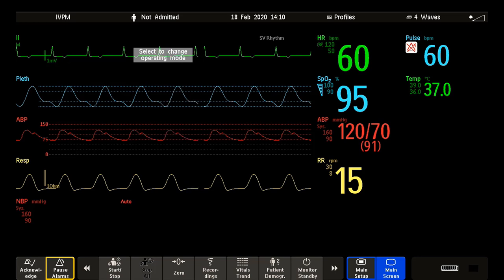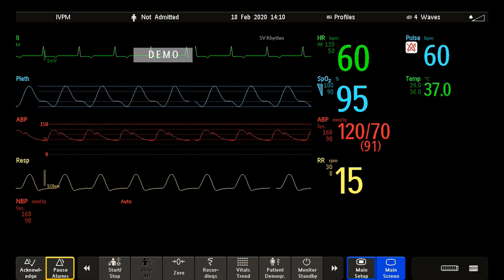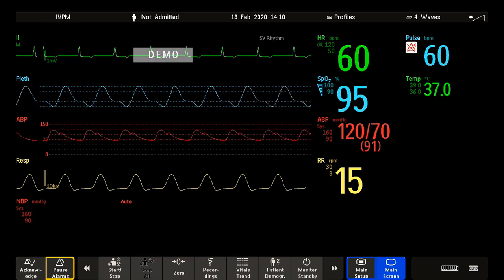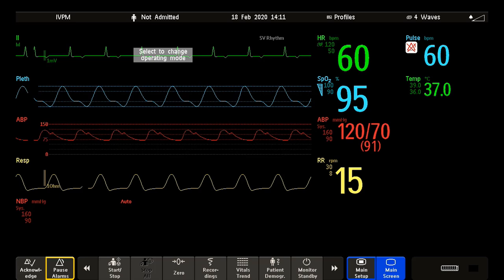Welcome to the Philips Intelliview Patient Monitoring Microlearnings. In this video, I will talk about monitor alarms and how you can adjust and review alarm settings. Let's get started. First, I want to familiarize you with the standard visual and audible alarm indicators of your Intelliview Patient Monitor.